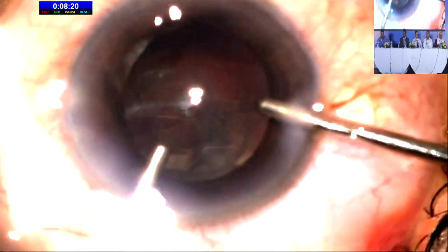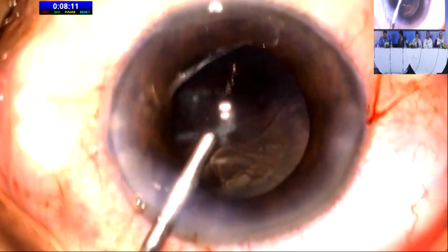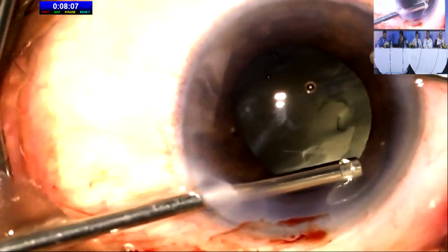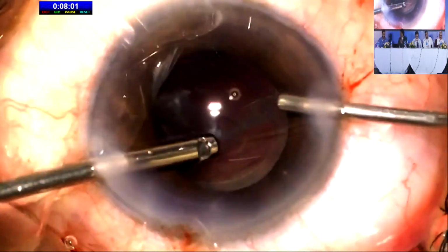I have some doubt about whether or not there is some vitreous disturbance, and so I inject some triamcinolone acetonide into the anterior chamber to look for it. A small, limited anterior vitrectomy is performed in the area of the pupillary plane overlying the PCR.